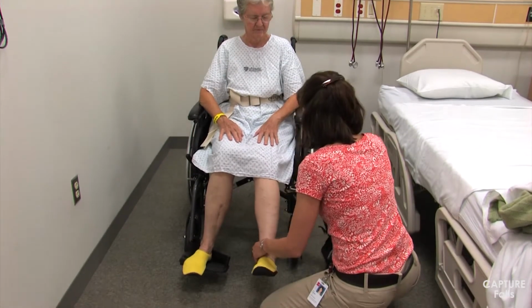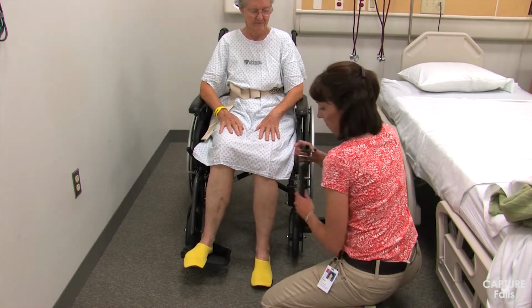This video assumes that you have already gathered any items that you may need, such as a gait belt and non-slip socks, prior to initiating the transfer. It begins by showing the wheelchair positioned as close as possible to the bed. The wheelchair should be positioned adjacent to the bed, but at a slight angle rather than parallel. To get the wheelchair adjacent to the bed, the leg rest closest to the bed should be removed.